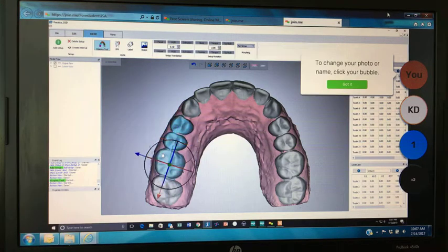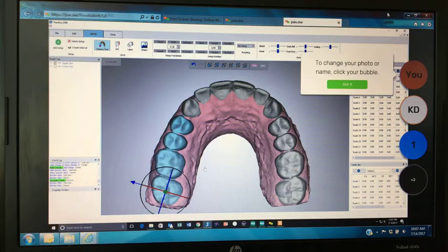All right. Now there is one rule with groups of teeth. You can't use this gyro tool to move the whole set. You actually have to use the buttons. Oops, going the wrong way. Up here to move them as a group. Okay, and so you'll notice I've moved that whole set as one.